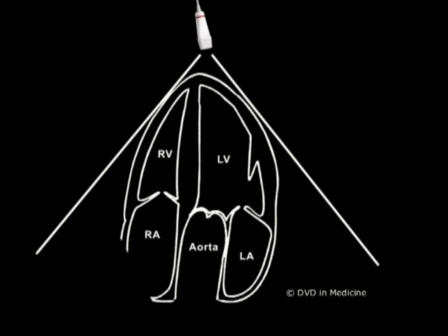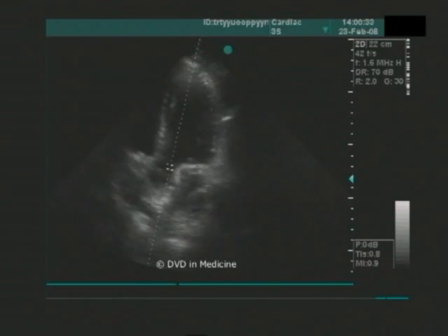In this clip, we demonstrate yet one more example of eliminating the aliasing by using the apical approach in the pulsed Doppler assessment of the aortic valve.